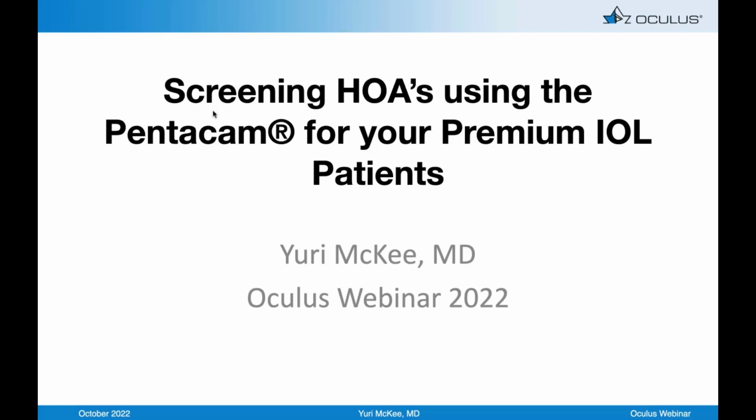One was getting back to you talking about the back-front ratio and utilizing that to determine whether a patient may have had a myopic or hyperopic refractive corneal procedure. The question is, when trying to determine the hyperopic versus myopic ablation, how accurate or helpful is the refractive change box in the Holladay report at the upper right? So do you look at that at all, or do you just really look at the back-front ratio? No, the back-front ratio is the most important thing.